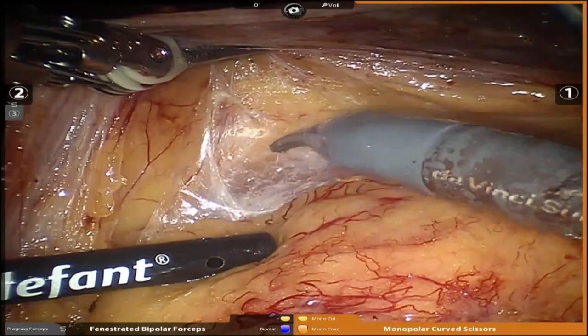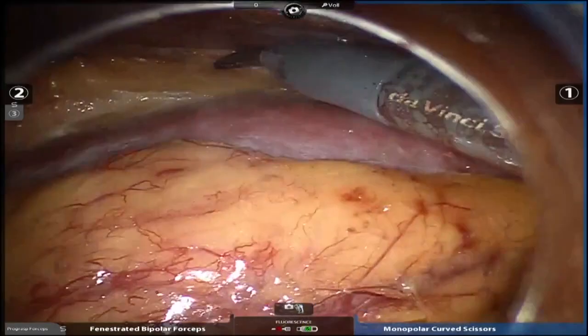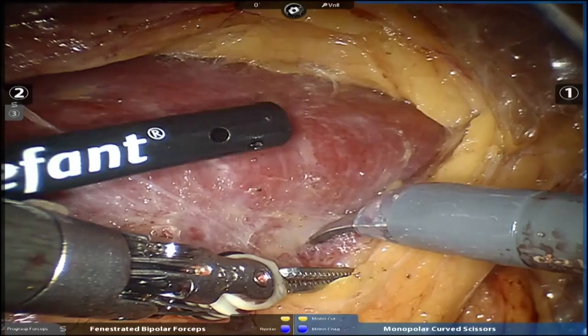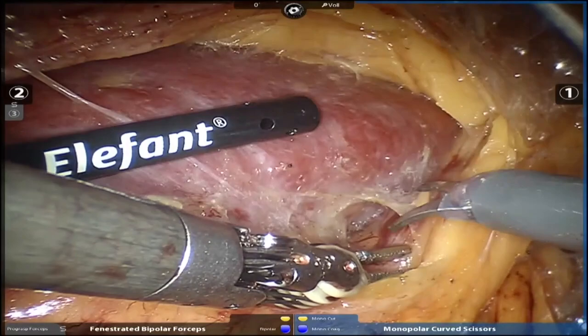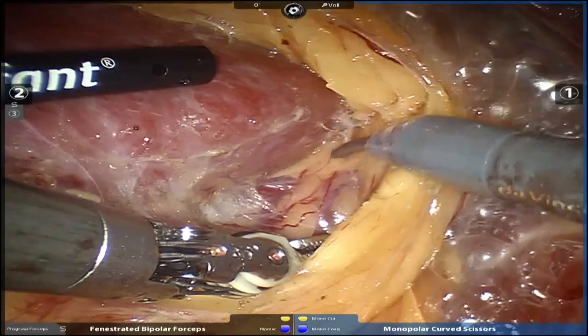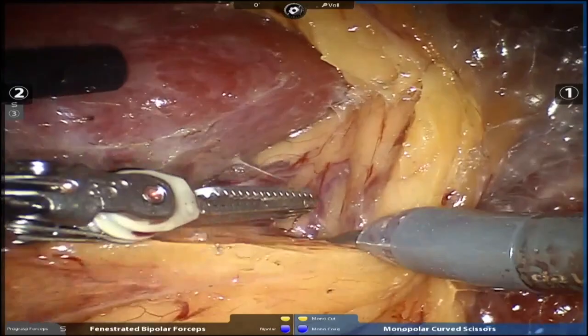In cases when the fat is not as compliant upon removal off the capsule, do you just keep chipping away and keep moving on, or do you have some sort of tip to help with those? Because those can be really painful, as you know. Yeah, I think sticky fat happens, it's something you have to deal with. The key with the sticky fat, the thing I found, is to not get subcapsular. So I try to work about a millimeter above what I think the kidney is. It's okay to leave a little bit of fat on, but you need that capsule for your closure and for other things. So the key is not to get too close when you have sticky fat, and that will help ensure that you have something to close when we're all done.